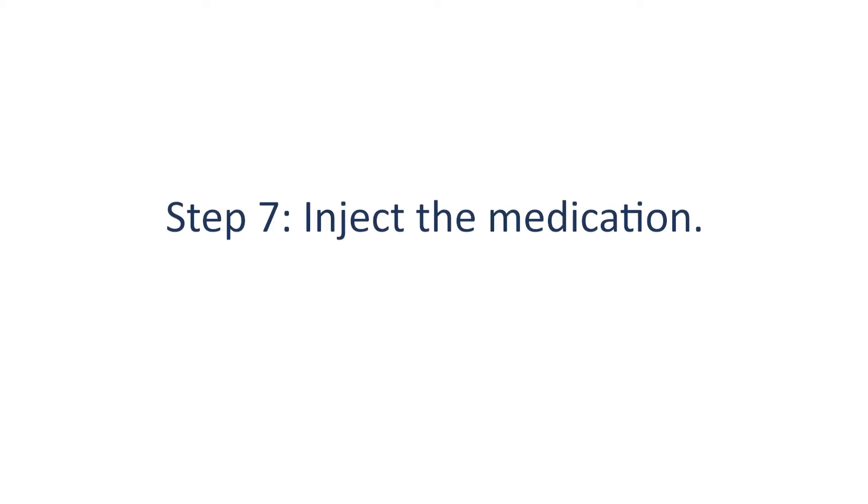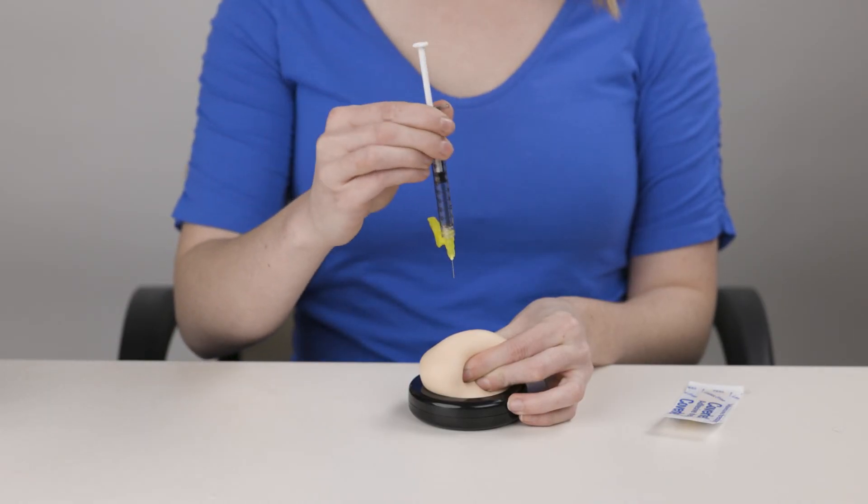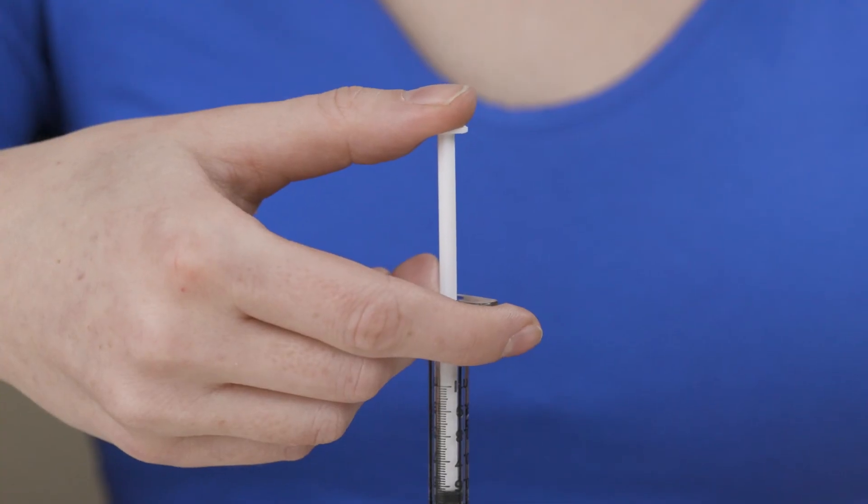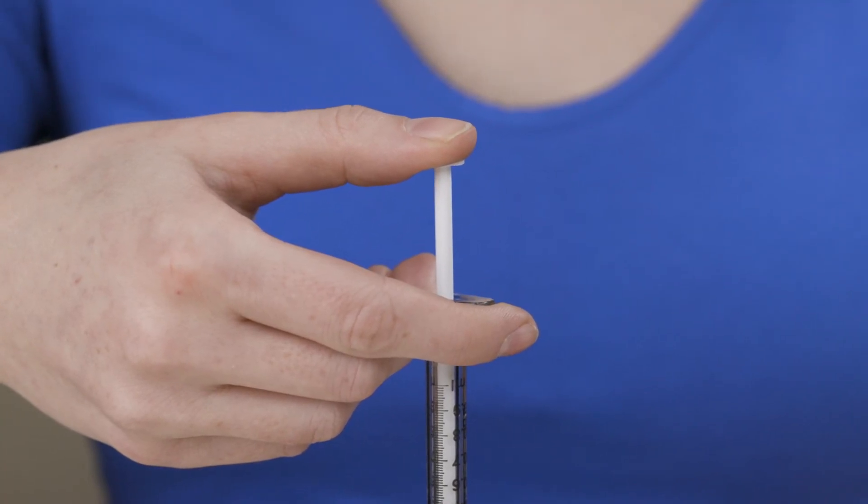Step seven, inject the medication. Put the needle straight into the pinched skin in one smooth, quick motion. Use your thumb or index finger to slowly push the plunger all the way down until all the medication is injected.